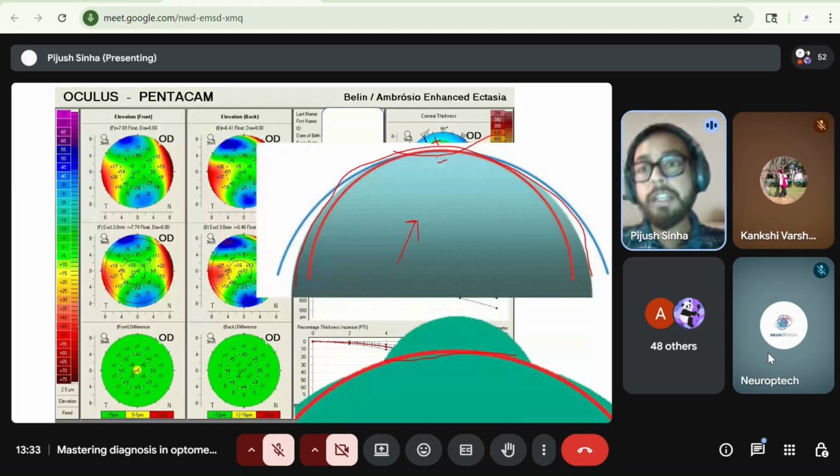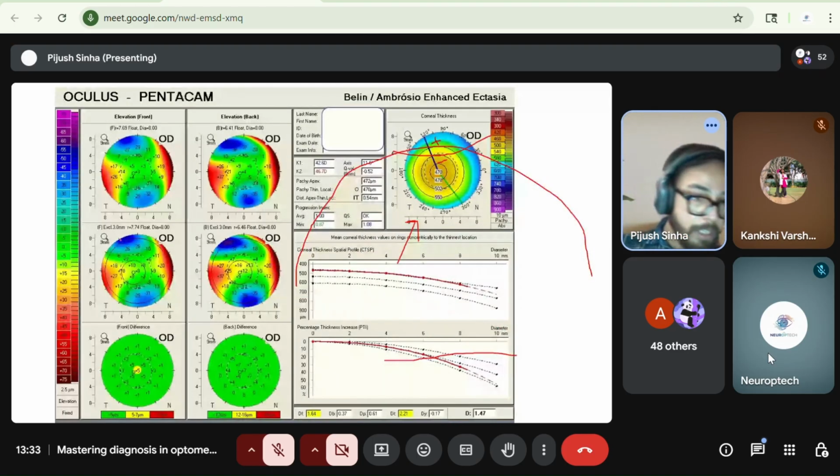Nowadays, there is an additional refractive map that is included in the Pentacam. Previously, we did 4 refractive map with Belin. Nowadays, corneal ABCD grading has also come to play its role. So keratoconus grading with ABCD, where A indicates the anterior corneal curvature, B indicates posterior corneal curvature, C is the CCT, and D is the visual acuity. So the ABCD grading is also in a very working manner in many institutions to grade the keratoconus. But even after that, yeah, the importance of this Belin-Ambrosio map is very powerful.